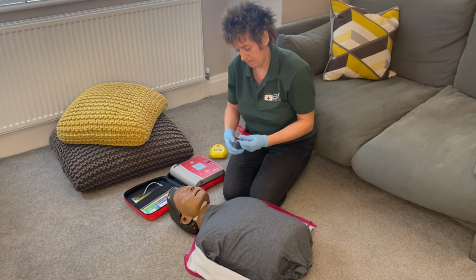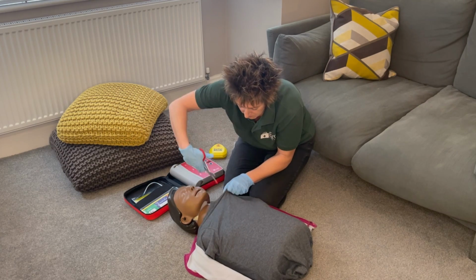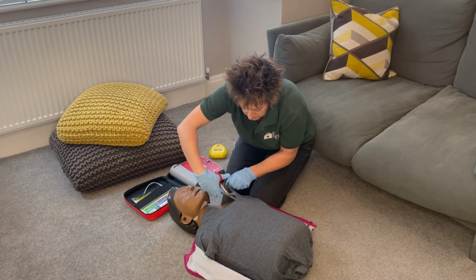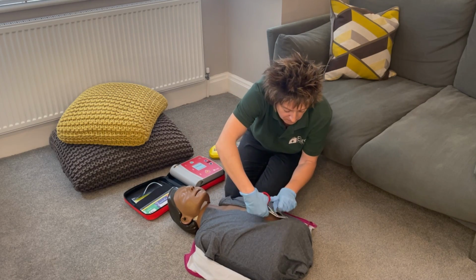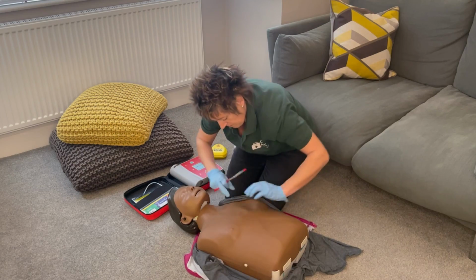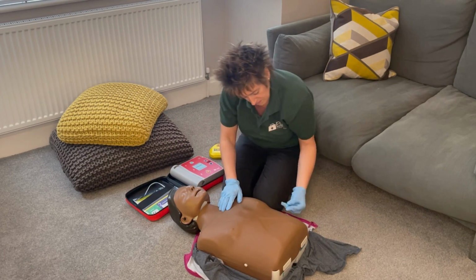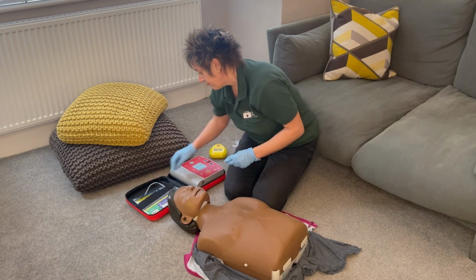So I'm going to unzip the jacket and then I'm going to use the scissors and place a cut at the top of the t-shirt. Might try and rip it. That doesn't work. I will then keep cutting all the way down. Remember, neck down to belly. I'll make sure that they're not hairy, and if they were hairy, I need to shave them where the pads would go. And maybe dry them if they're very clammy or sweaty.